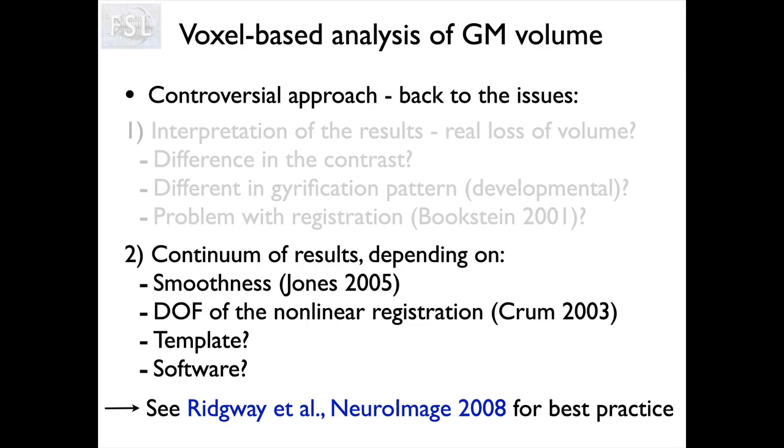This is true not just of VBM, but it's been well studied in VBM, so it's good to understand that. And it's something that the community is aware of and reviewers of your papers are likely to be aware of. So you need to understand what the impact could be and how reliable the results are meant to be. But at the same time, it's been around for a long time, it's been heavily used, and it is one of the mainstays of certainly structural analysis.